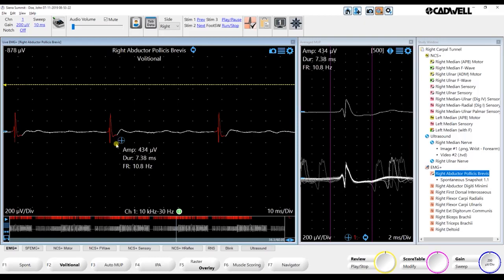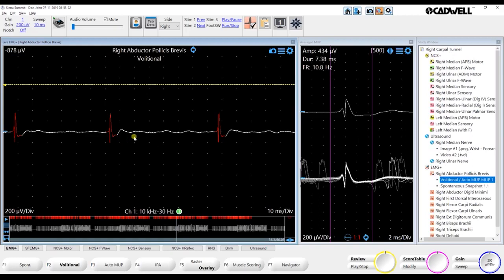What that did is, over in the right hand window, I'm going to hit plus here because I want to keep this. It went through the buffer and found all the motor units that looked like that motor unit. In this case, it found 500. And then it averaged some of those to give us a nice average trace. You have control over how it averages them. You can also display, right now we're overlaying all of them, which is nice if you want to exclude some of the erroneous data that may affect the actual numbers.